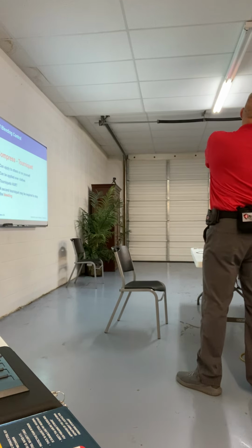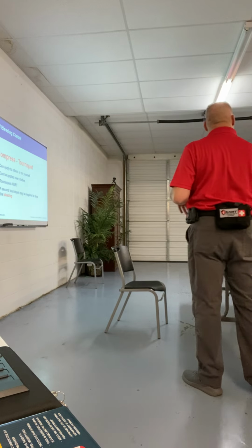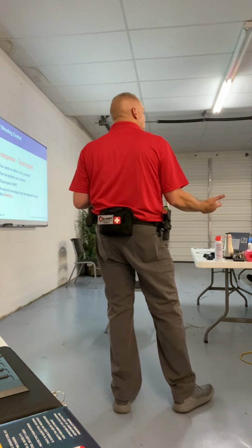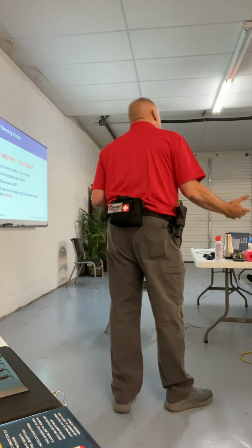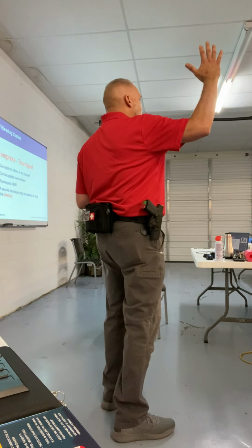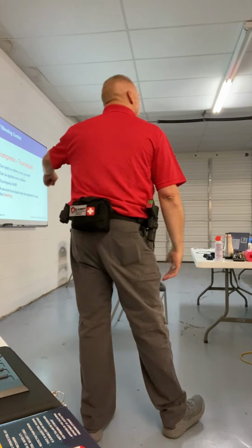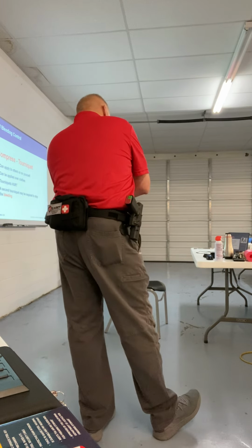If you place that first tourniquet and initially the bleeding has stopped, but then you move the patient and the bleeding restarts, how do we address that? You reassess. Well, we reassess. It's bleeding. So where do we go from there? Remove the tourniquet. How many of y'all remove the tourniquet? That first one fails. If you have another commercial tourniquet, apply that.